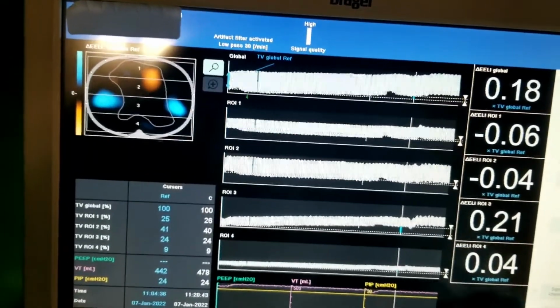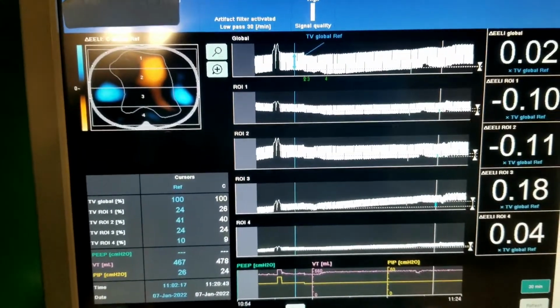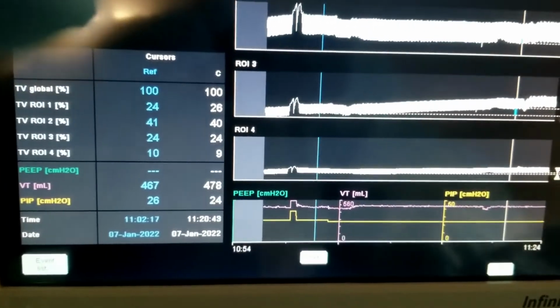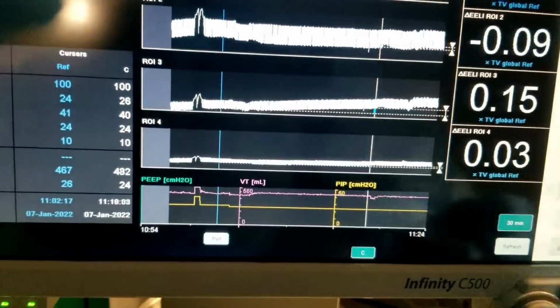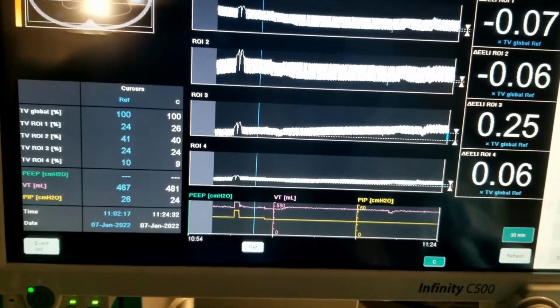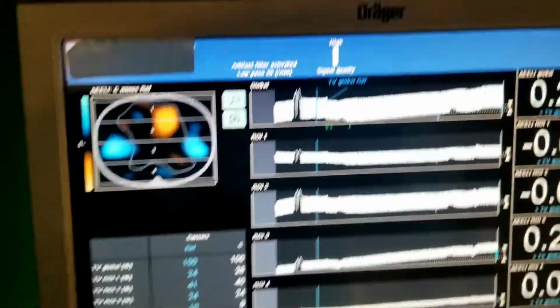I'm just going to bring it a little longer, just refreshing the page. All right, so now we're in the end expiratory lung impedance. Again, you're following here, right here. This is my 26. And now I'm going to bring this guy here from the 26. I'm going to bring it across now. So that's roughly 25 minutes. So let's look after 25 minutes what's happening.